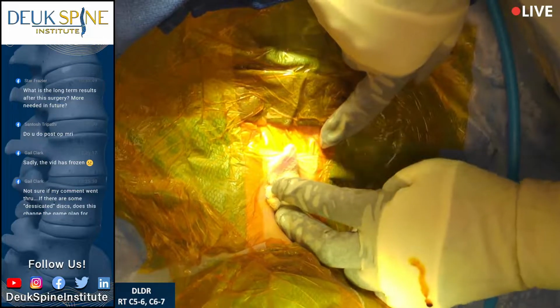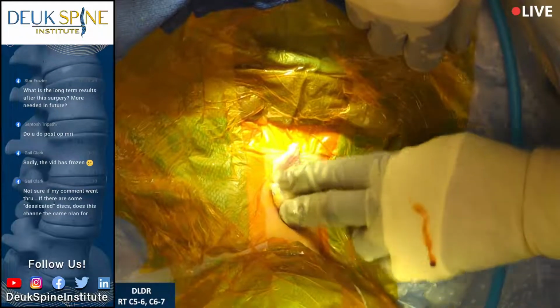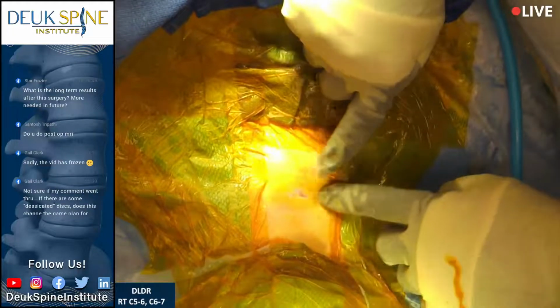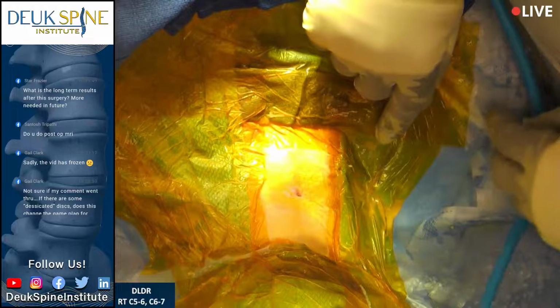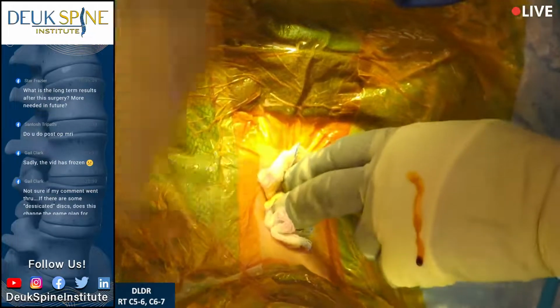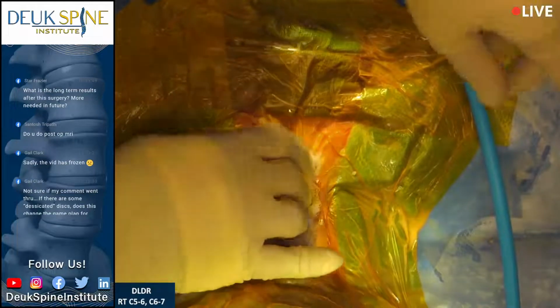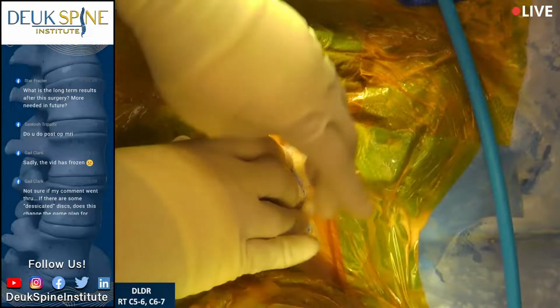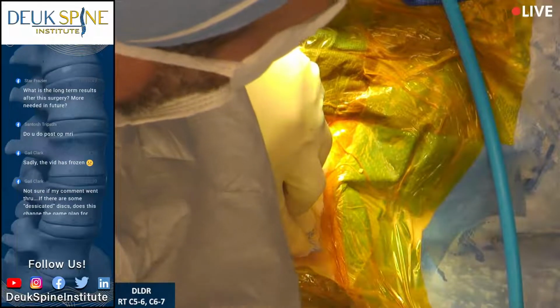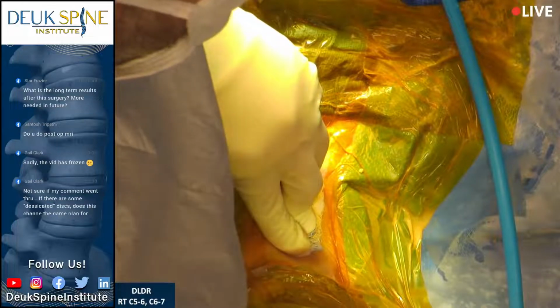You can actually see the artery pulsing right there, called the carotid artery. You all see that? Pretty cool. All right, let me show you the incision. 4 millimeters right there. And you can see the neck is supple. There's no blood clot. We'll hold another minute and then we'll put a steri strip and a Band-Aid. This is outpatient spine surgery, folks. ACDF, very invasive surgery. And once again, why don't you show the comparison video, Flynn, between ACDF and Deuk laser disc repair so people can appreciate the difference.